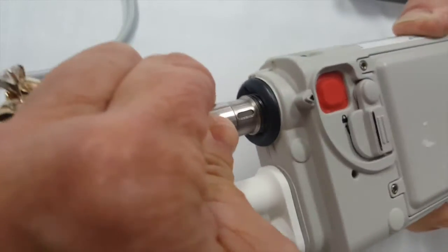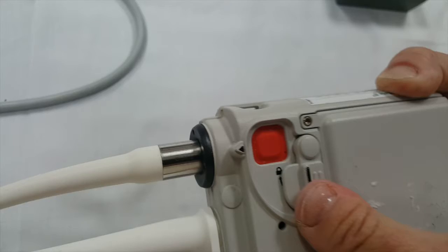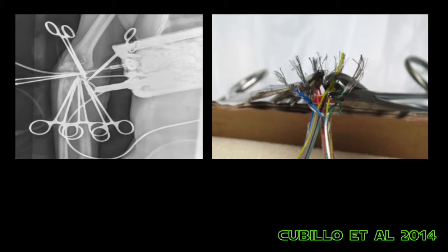Next, check the drive line, which is the cable that supplies power to the VAD motor. Make sure the connector pin is securely in place. The switch on the back of the control box will not close unless the connector is correctly inserted. Also, in the unlikely event that your drive wire has been transected, you can MacGyver it back together, connecting the colored wires with clamps and electrical tape.